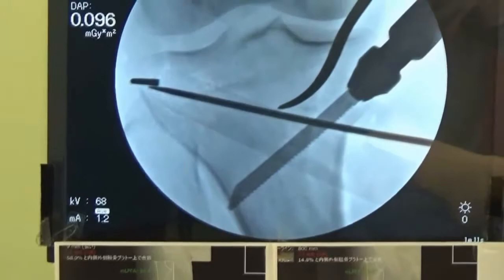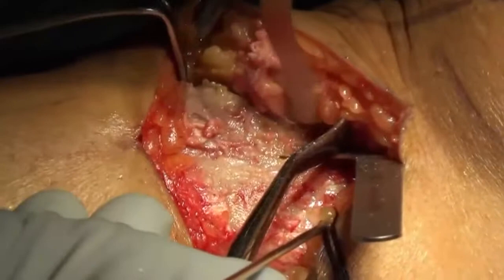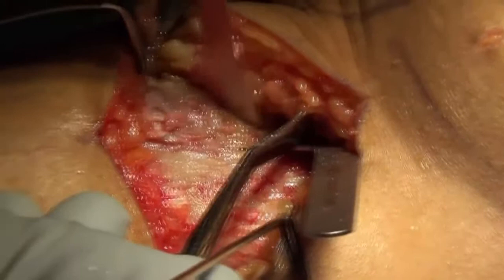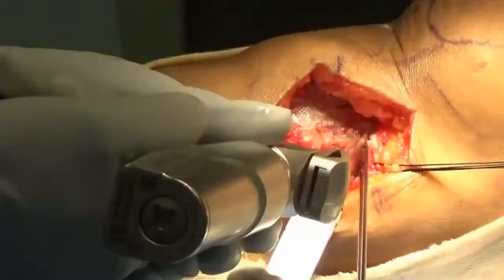The arc osteotomy is made using a small bone saw by connecting all the dots. Finally, using an oscillating saw, the transverse osteotomy is begun beneath and parallel to the guide wire with the lateral hinge intact.